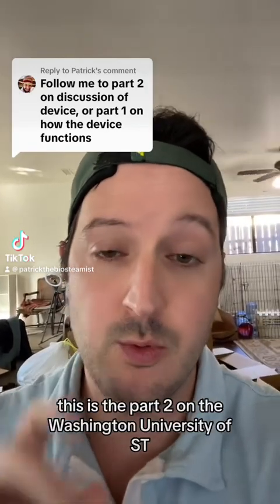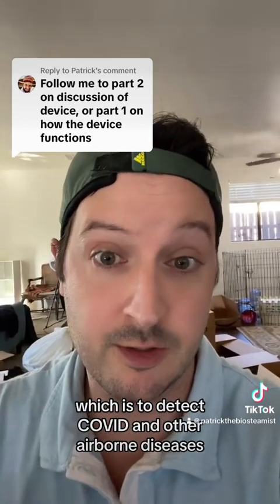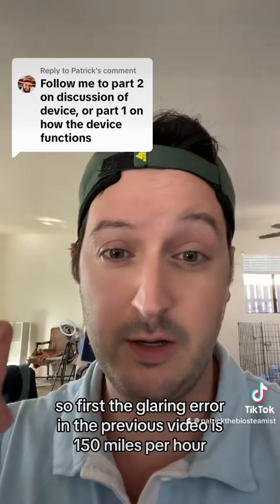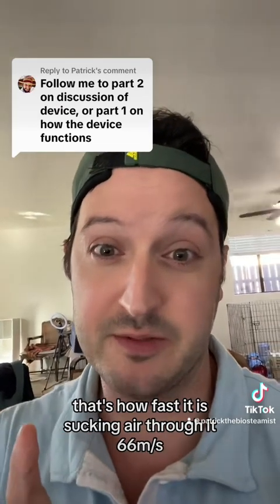This is part 2 on the Washington University of St. Louis air monitor, the PAC device, which is to detect COVID and other airborne diseases. So first, the glaring error in the previous video is 150 miles per hour. That's how fast it is sucking air through it.